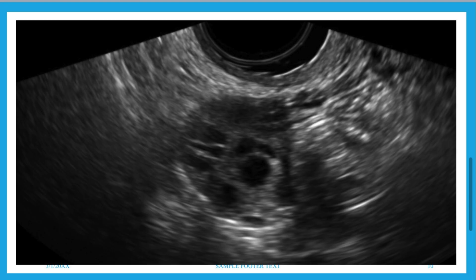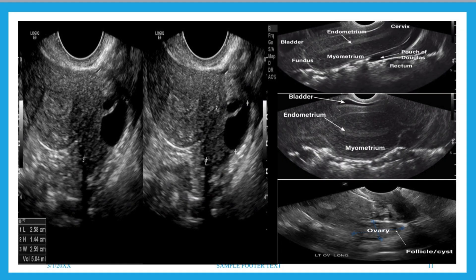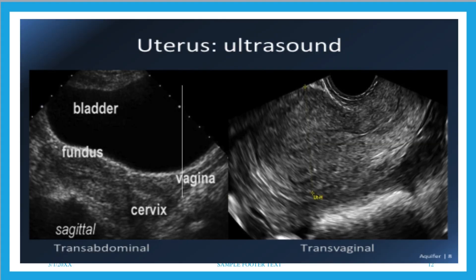In this image we see a normal left ovary. We have a 34-year-old normal adult female pelvic transvaginal ultrasound — the endometrium is thin on the labeled images and thick on the left image, which could be due to positioning. What could be mistaken for cysts in the ovaries are just physiological follicles.